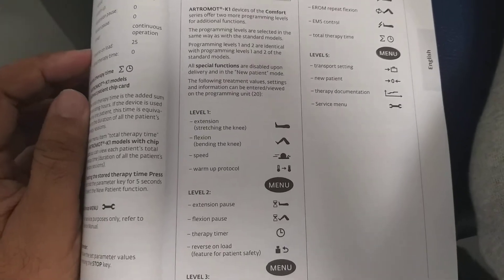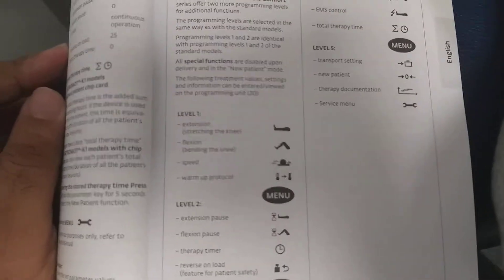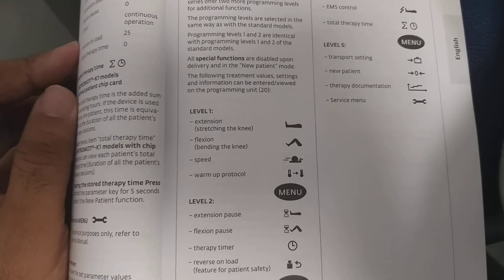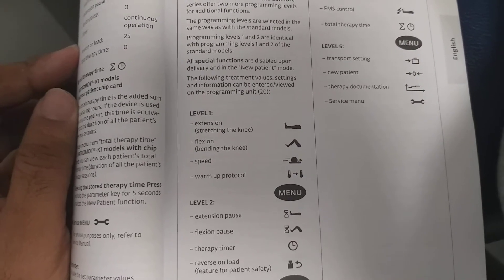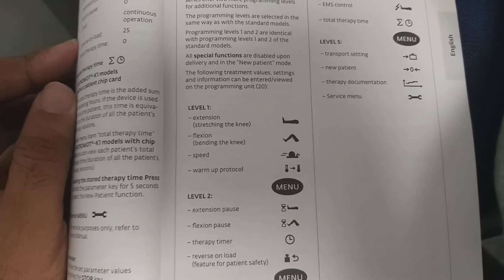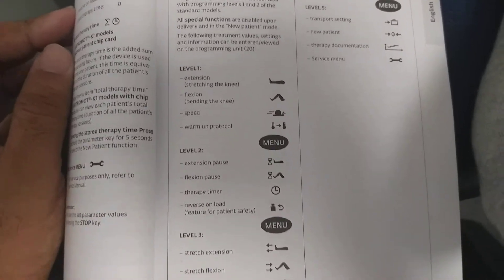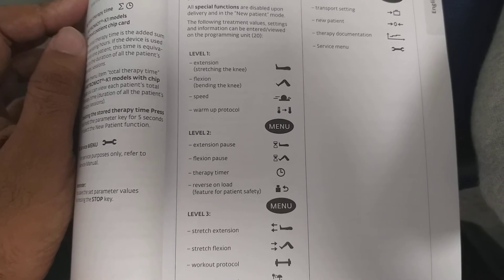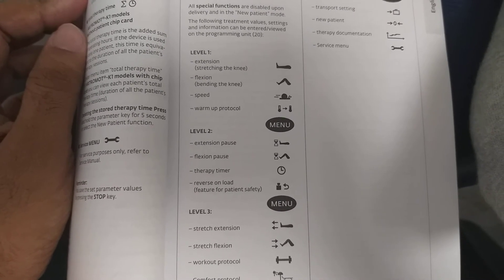In the remote you can see level 1, level 2, level 3, level 4, and level 5. In level 1 you can set the extension angle, flexion angle, speed, and warm-up protocol. Level 2 has extension pause, flexion pause, therapy timer, and reverse load.